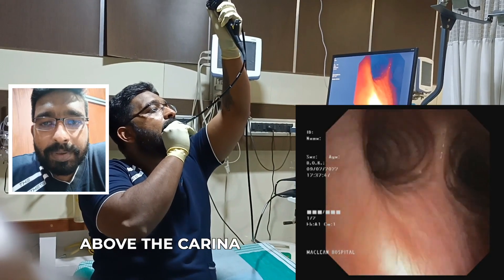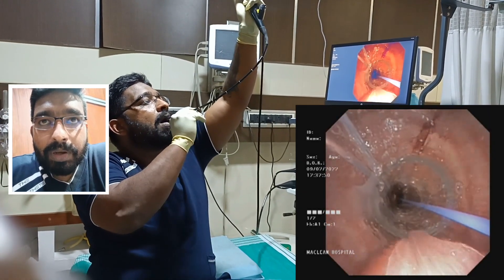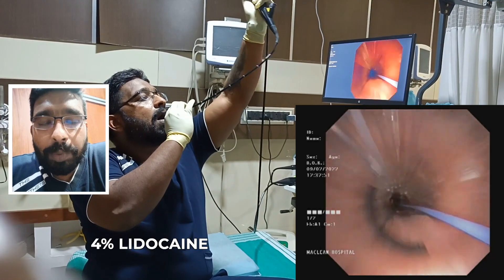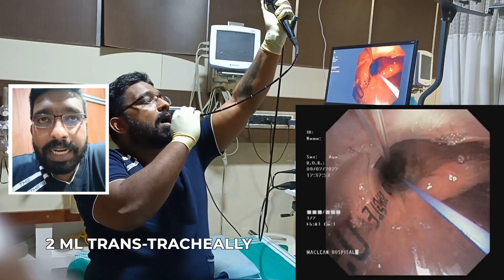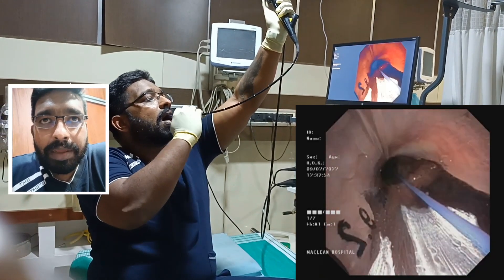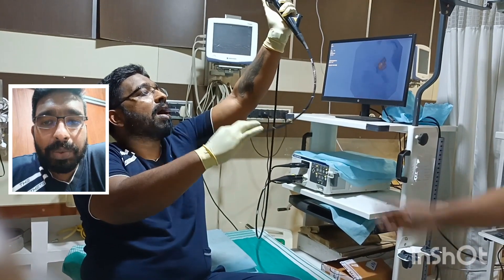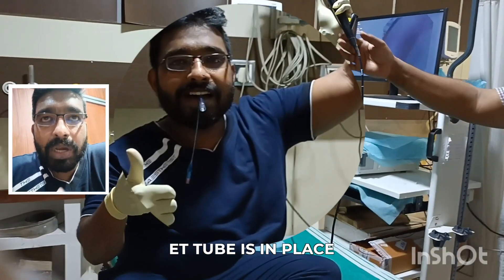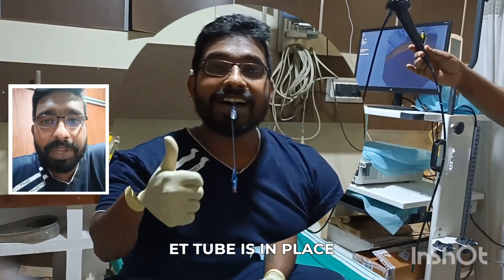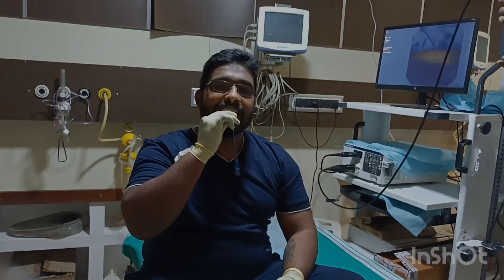And how much local anesthetic do you inject transtracheally? Four percent, two ml — I injected and voluntarily coughed to spray it just below the cords, and also coughed to get the local anesthetic to spread upward as well.